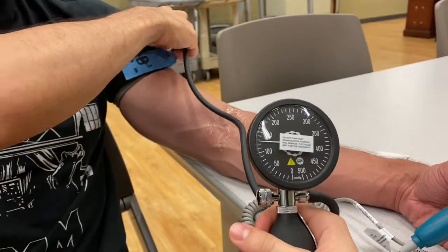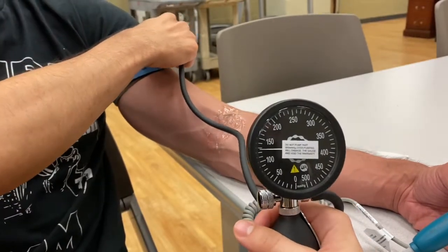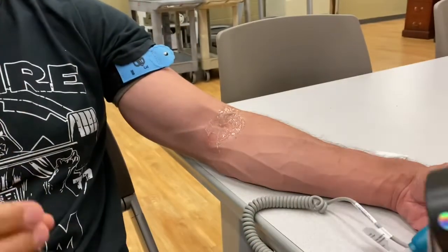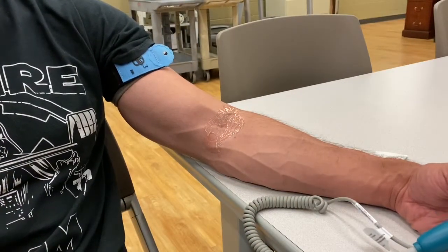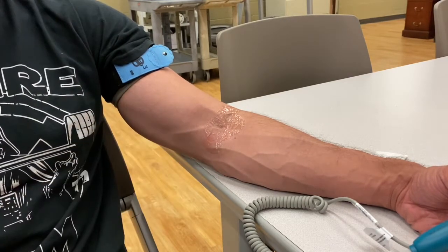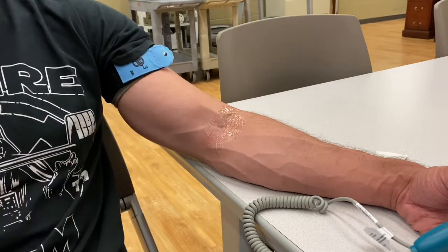Good. What you're going to want to do is you don't want to be exercising with this sphig attached to it, so we're going to be disconnecting this part. You're going to lose a little bit of pressure by doing that, but it's still going to be effective. So this would be the amount of pressure you'd be working out at. Just make sure that you wipe the ultrasound gel off.